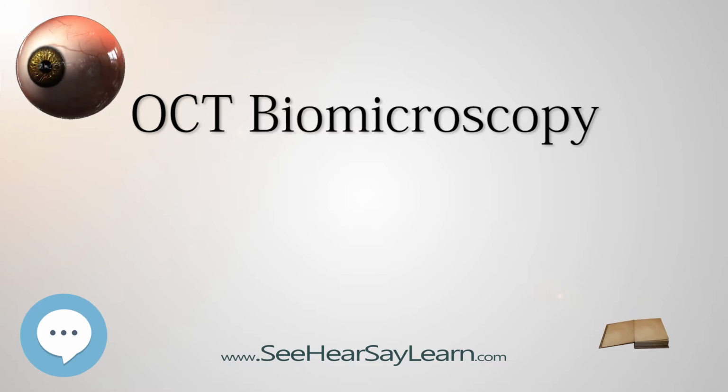Another limitation of slit lamps is that they must be manually maneuvered during an examination. This freedom means that slit lamp exams may be conducted differently at different patient visits and in different locations around the world. And this variability may have a negative impact on standardization of terminology and exam protocols. Despite these features and limitations, slit lamp exams are still a cornerstone of the ophthalmic exam.